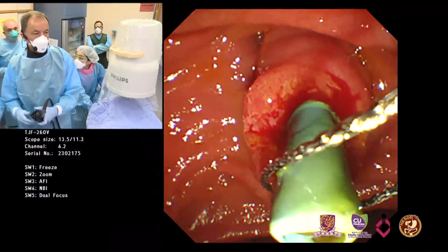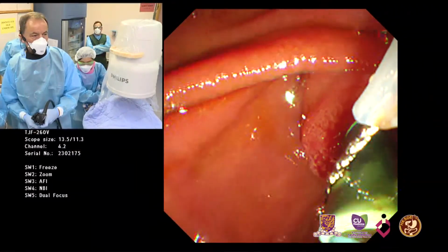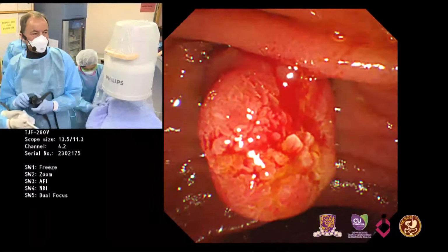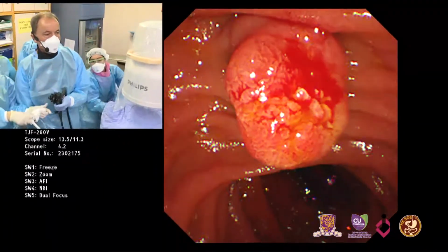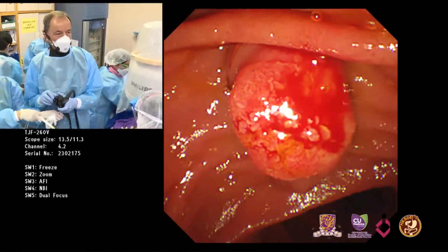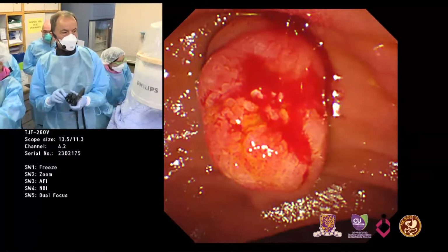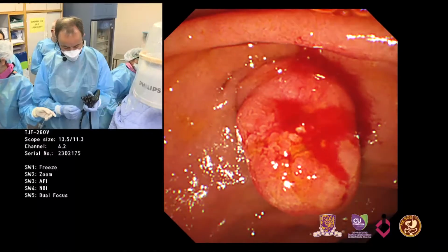this patient obviously needs a long-term biliary drainage because of this compressing lymph node. And therefore, we will exchange this plastic stent against the fully covered metal stent. I think this is a good indication. And as you can see, I grabbed the plastic stent at the very distal end with a snare so that we can pull it through the instrumentation channel.